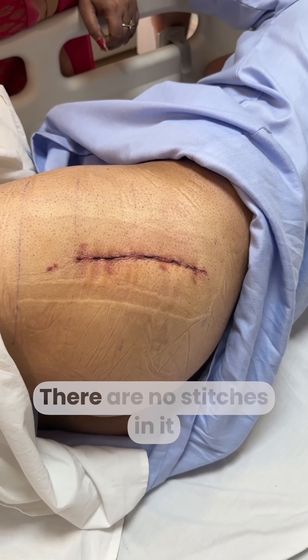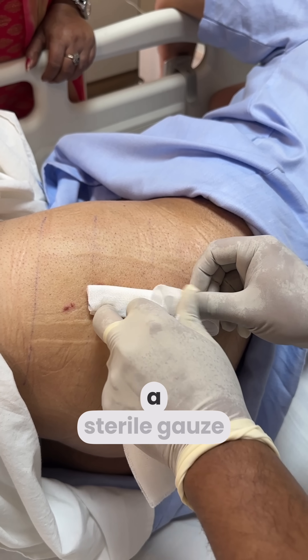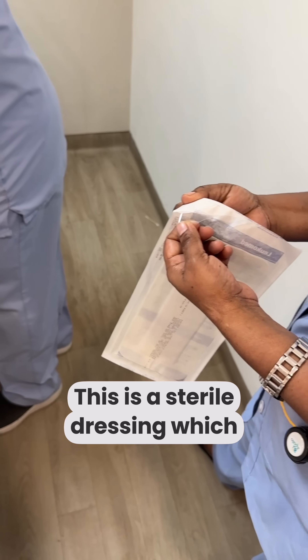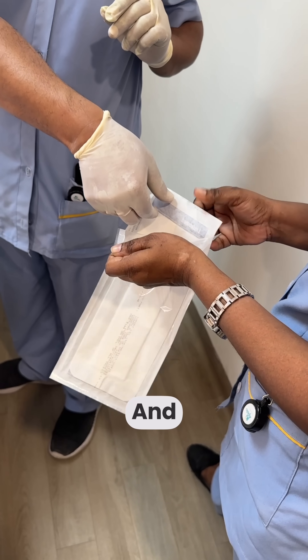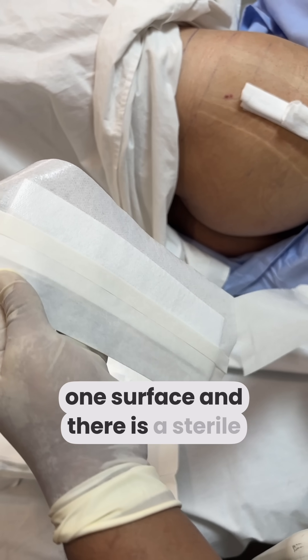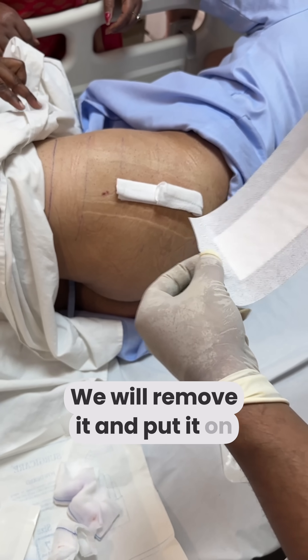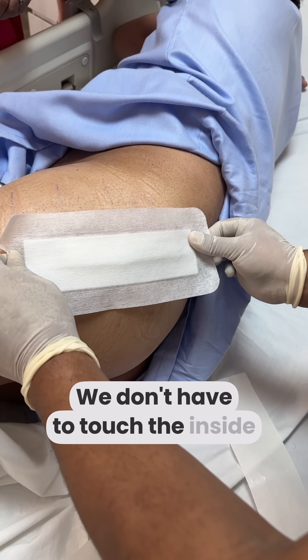There is no gauze piece needed here — this is a sterile dressing. We will open it and peel it. The dressing has layers on the surface. There is a sterile pad. We will remove it and place it on the padding, making sure not to touch the surface of the sterile pad.